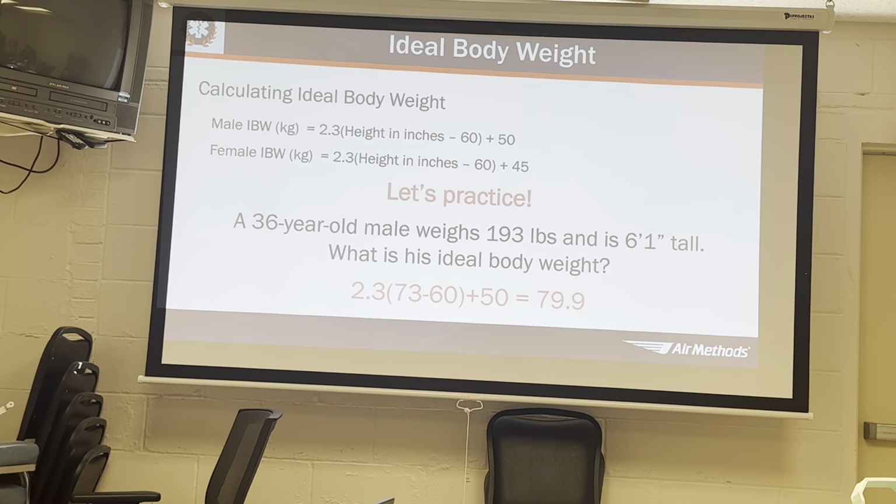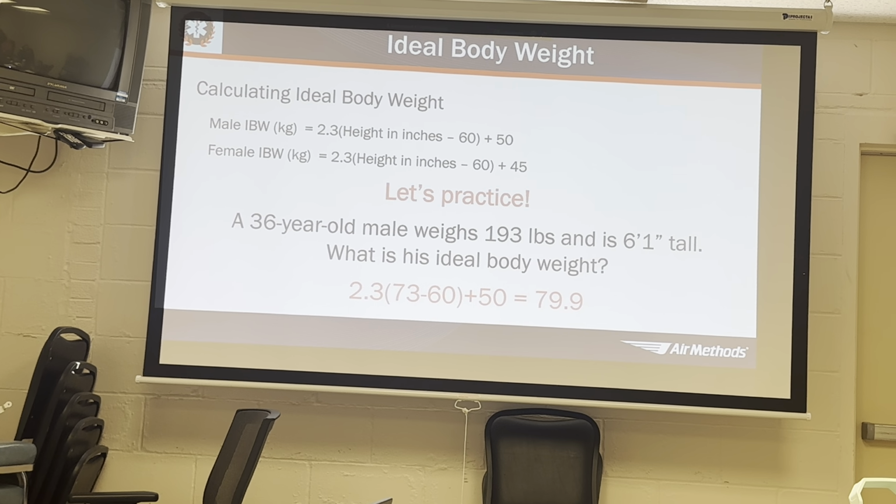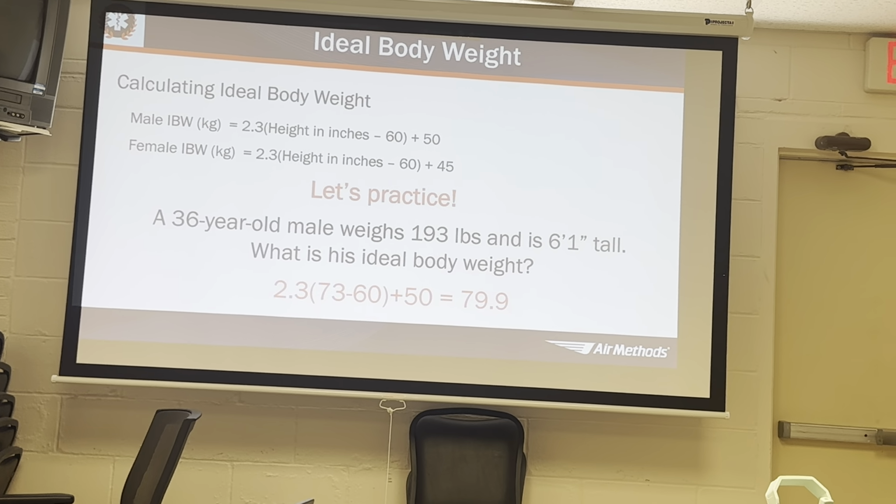It has an algorithm, and I have to go in, and then we make any adjustments based on what they're dealing with. So if they have ARDS, something like that, we want a lesser volume, and we would know to adjust that based on those guidelines. A healthy adult's usually about 6. If they're severely acidotic, we'll hit more of that 8 mL per kilo. But we also take into account whether they have some sort of lung pathophysiology that we don't want to worsen. So if they have severe ARDS, we'll limit them to a lower tidal volume and increase the rate to match that so they still meet their minute ventilation.